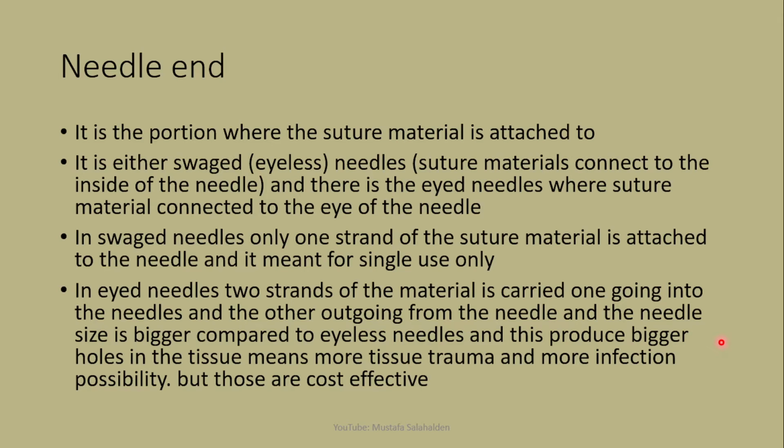And the swage needles have less infection possibility because they are single use, while the eyed needles have more infection possibility because those are reused and infection might be more possible using these needles.